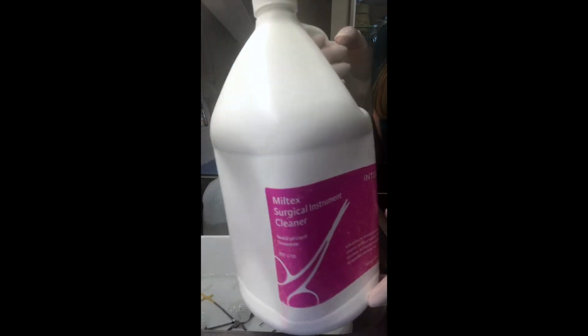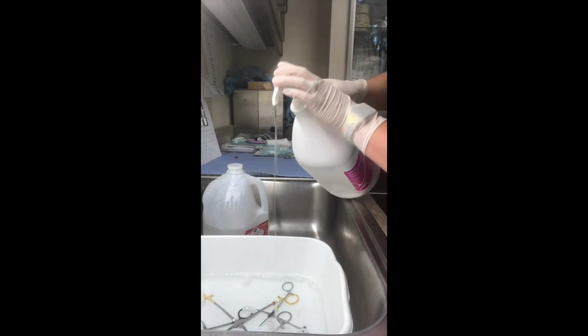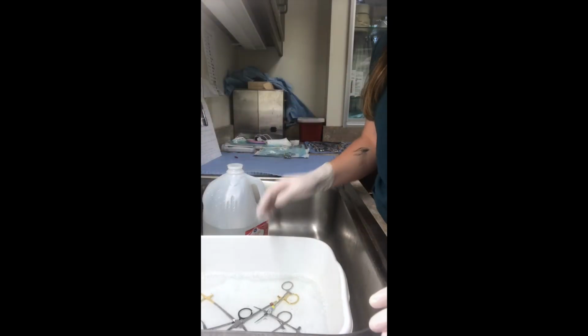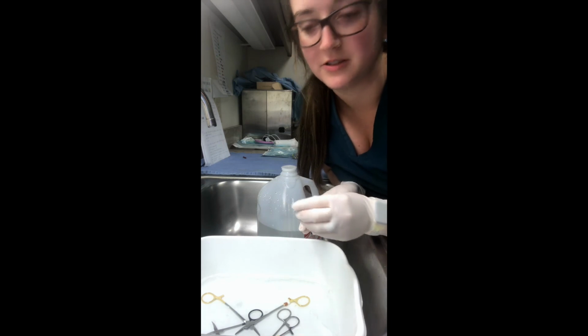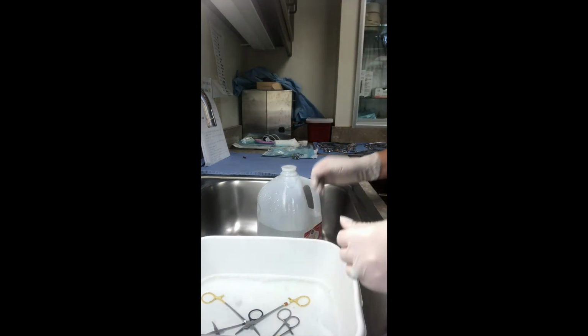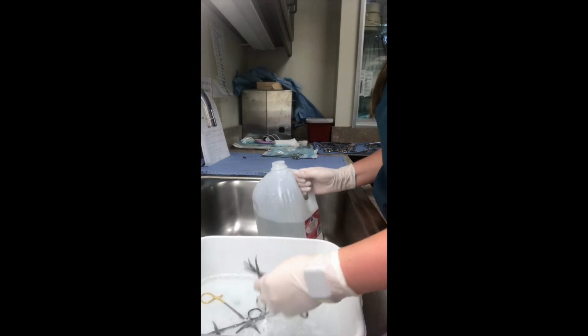And then we have our surgical instrument cleaners. We're going to use a pump of that. And then we're going to let that soak. And then we'll come back and rinse it. So after these are done pre-soaking, we're going to go ahead and rinse them with cold distilled water.